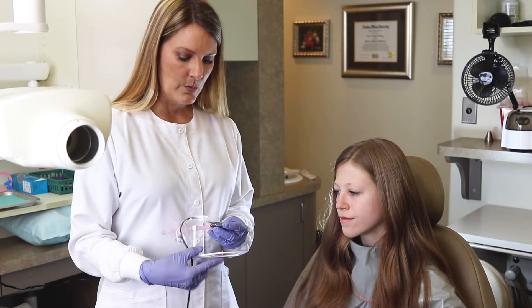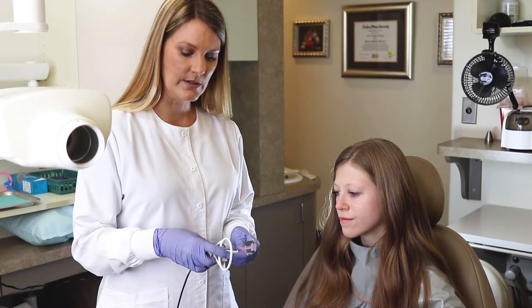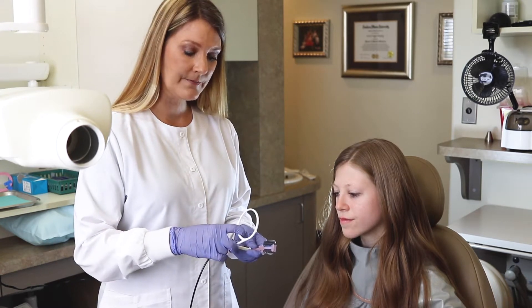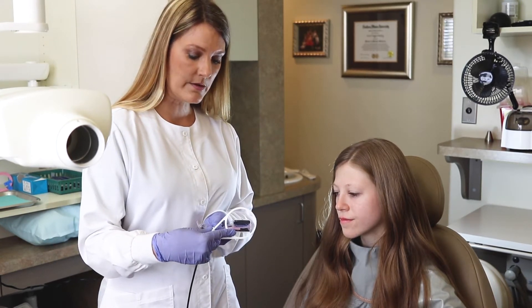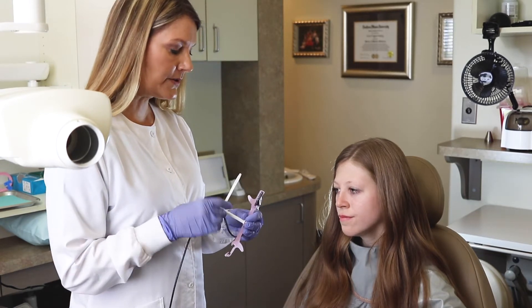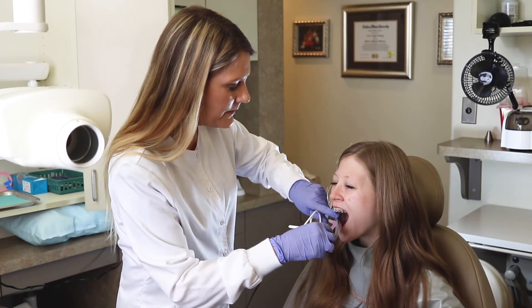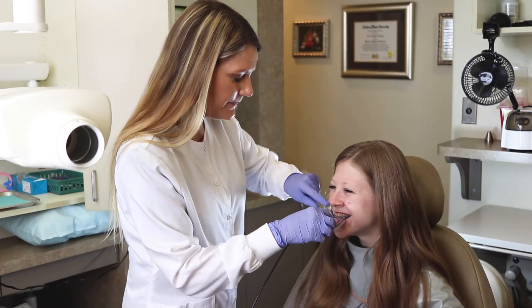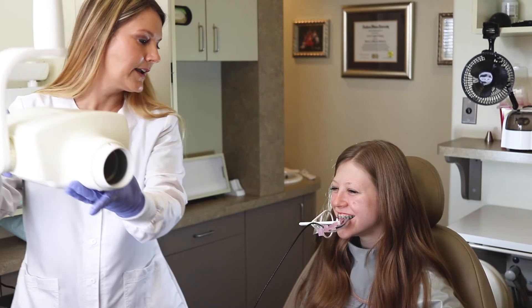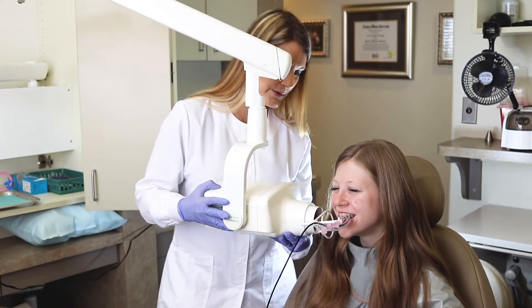When placing your sensor, you're going to want to start with it up high on one position, and then you're going to position the ring to the high position as well, so that we can actually go ahead and take some uppers and lowers with our model here. Go ahead and open, back down, and we're going to start with the posterior position here and take one there.